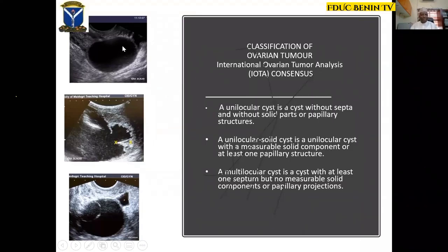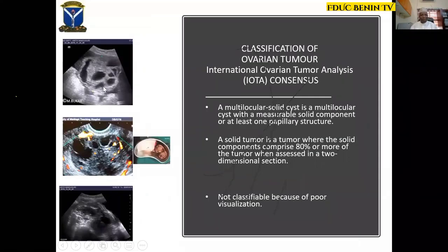A unilocular cyst is a cyst without septa and without any measurable solid components or papillary projections. A unilocular solid cyst is a unilocular cyst with a measurable solid component or papillary projection. A multilocular solid cyst is a multilocular cyst with at least a measurable solid component or papillary projection. A solid tumor is one where the solid components make up 80% or more of the tumor when assessed in two-dimensional sections, as seen in this adult granulosa cell tumor. Not classifiable means poor visualization, as in this case of dermoid with extensive shadowing.